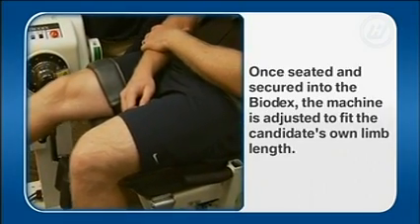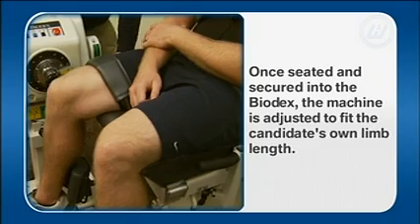Once seated and secured into the Biodex, the machine is adjusted to fit the candidate's own limb length.